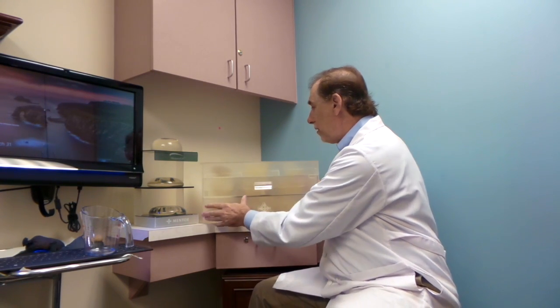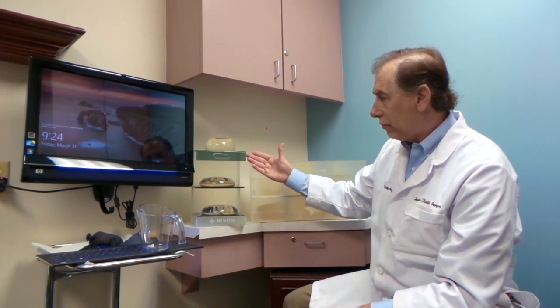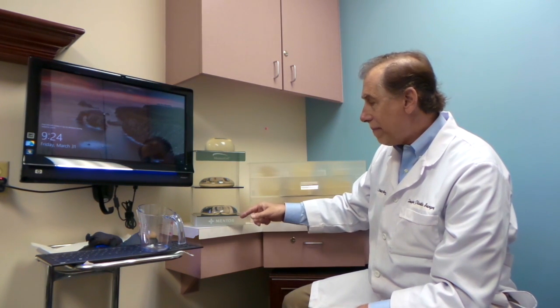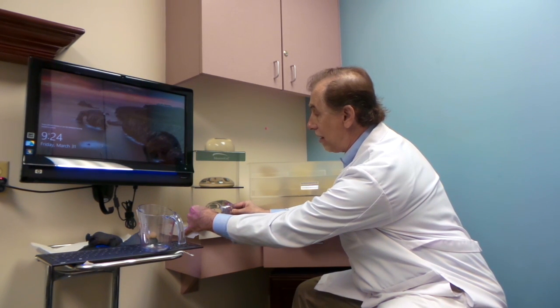The next thing we want to talk about is getting the correct implant shape for your chest. These three implants are the exact same volume. This is low profile, this is moderate profile, this is high profile. To make a high profile, the manufacturer takes the base and makes it narrower. We measure your chest — I want to give you maximum cleavage but no implant in the armpit. If you're wide-bodied and I put a high profile implant, you won't get as much cleavage. If you're narrow-chested and I put a low profile implant, great cleavage but implant in the armpit. We want to measure that implant so it fits at the base of your breast and gives the best cleavage without implant in the armpit.